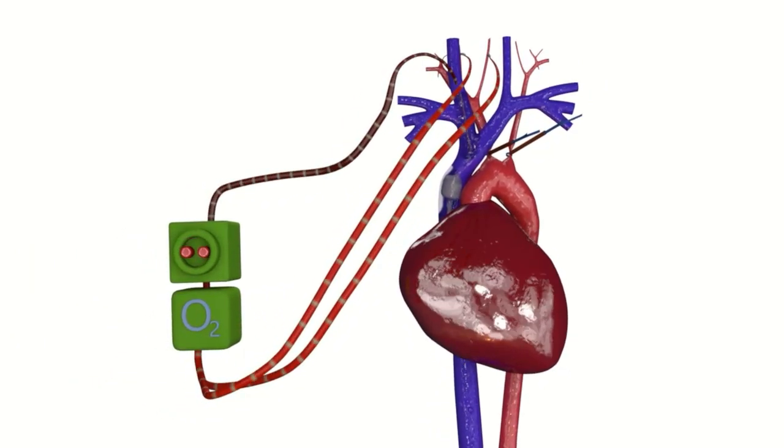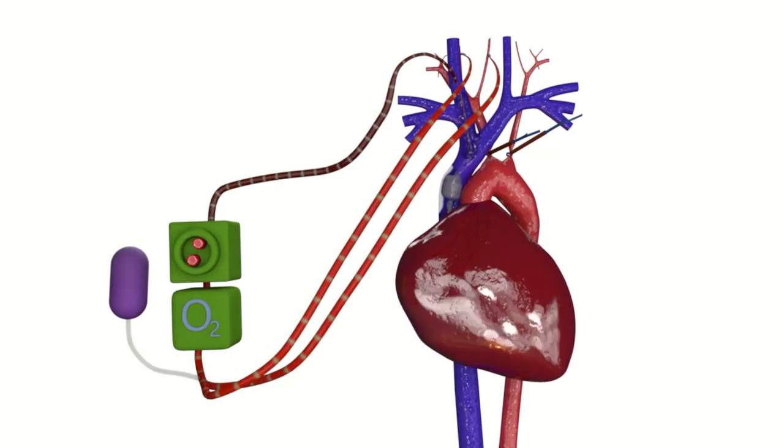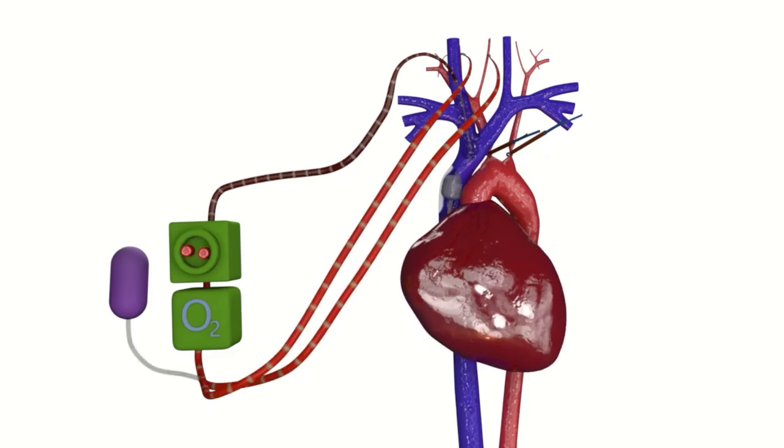A high-dose therapeutic agent is then introduced into the isolated perfusion circuit. Depending on the protocol, drug perfusion may last from 10 to 60 minutes, with other durations also being feasible.